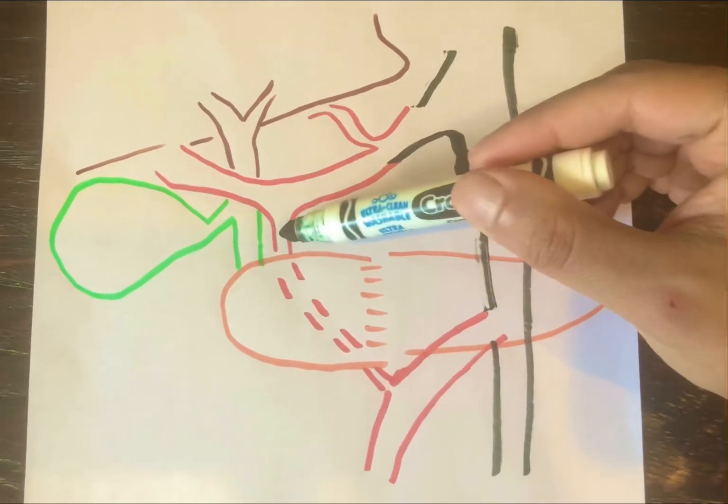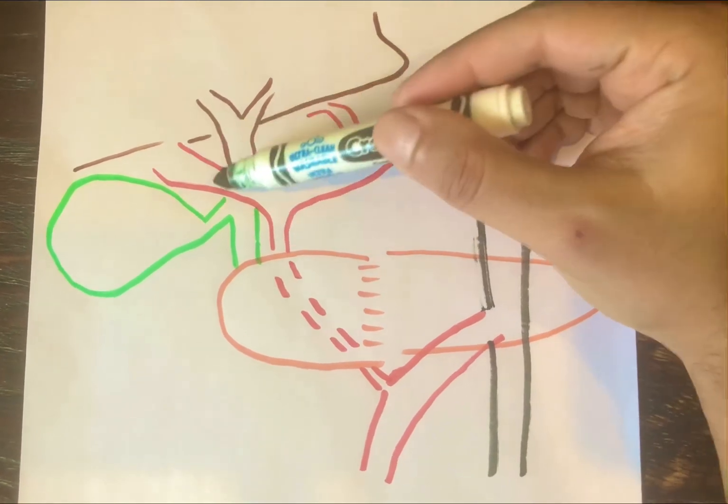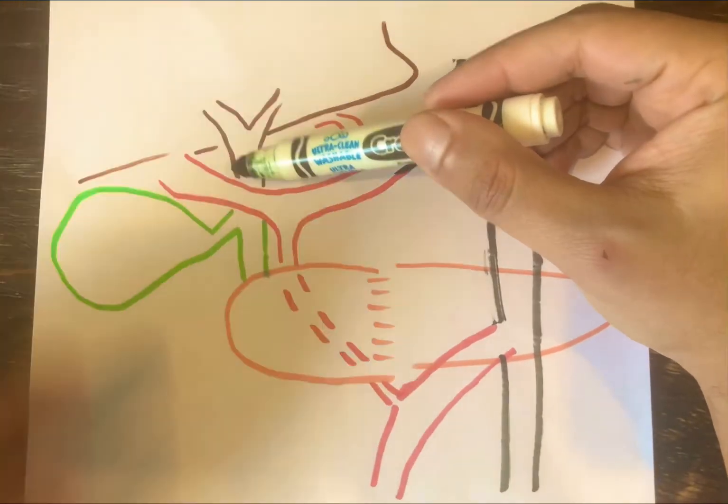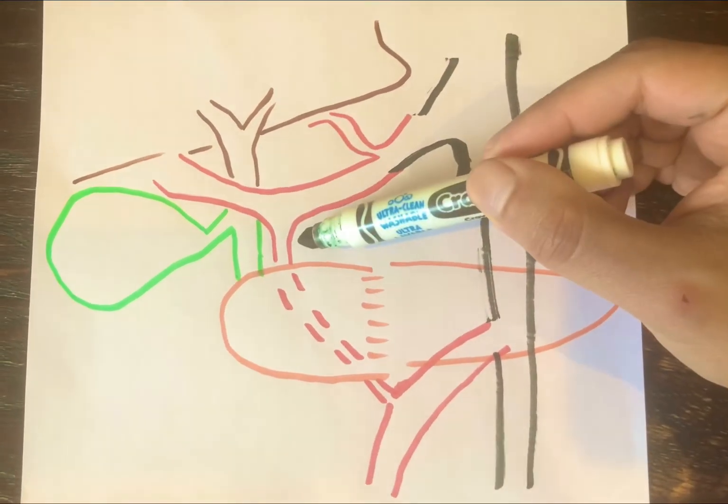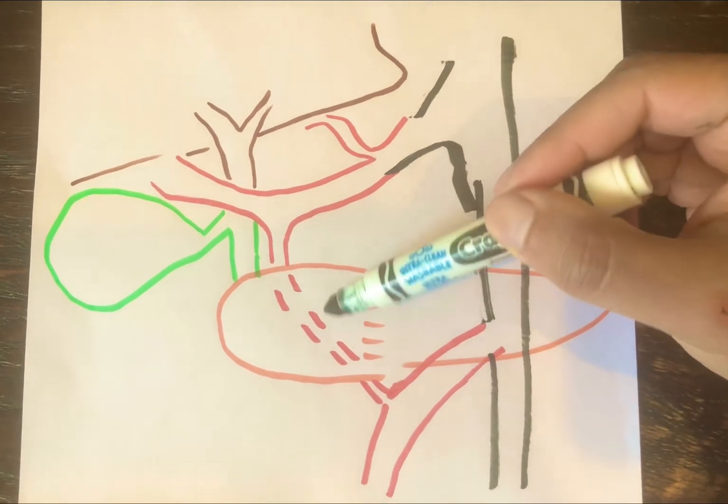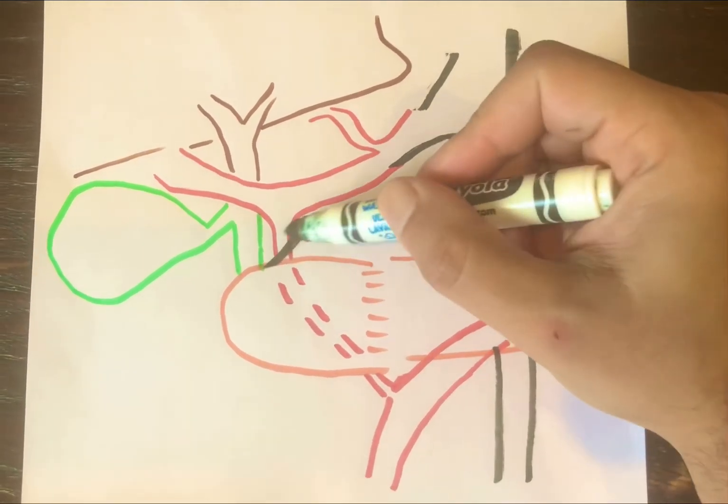So when you tie this off—again, before you tie this off, you feel for a pulse, you feel for a signal, you're not going to get it because this is not the GDA. This is the right hepatic artery. Now, what if you tie it off?